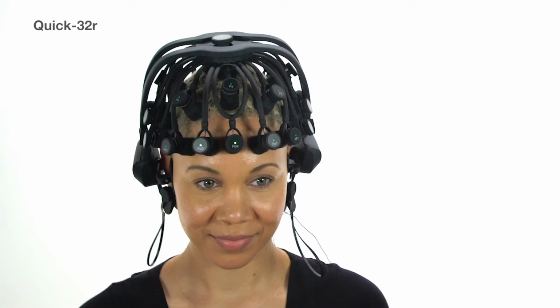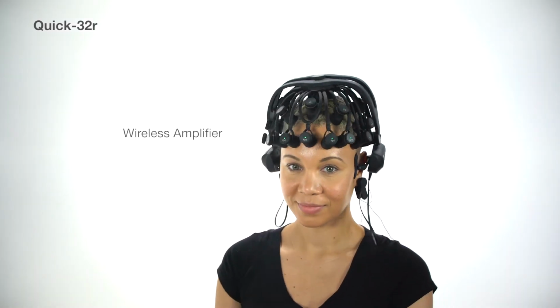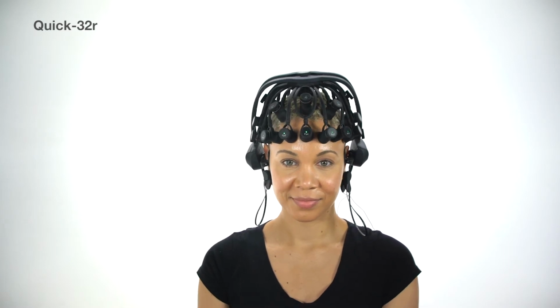Here's a brief overview. These are the sensor pods, the legs, and the ear pads. Here are the handles we'll use to put the headset on. The A1 handle connects reference and ground to the A1 ear clip. The A2 handle can be used with an A2 ear clip and also contains ports for 2 EXG channels. The wireless amplifier collects signals, transmitting them to the Bluetooth dongle.